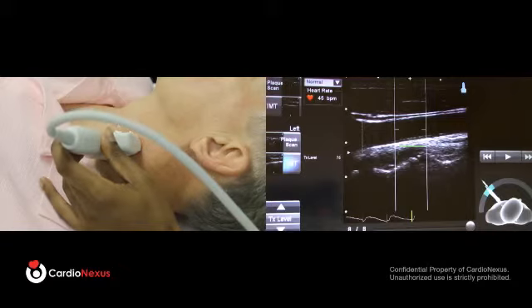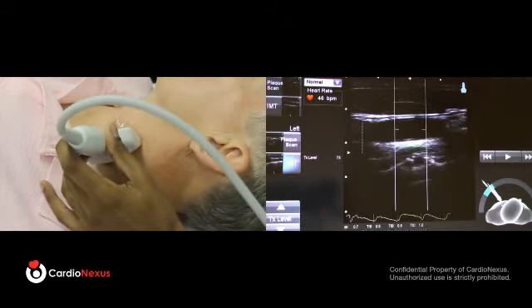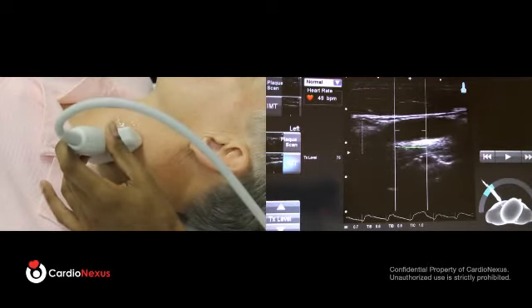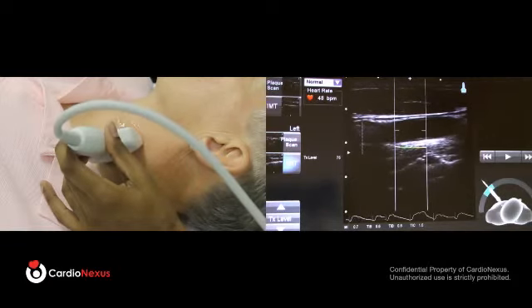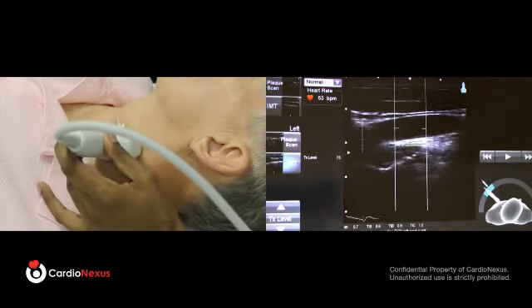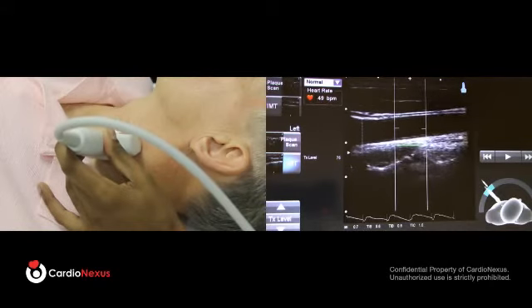So I'm going to do that one more time. In the case where you've located the artery, but it's considered an oblique view, kind of an oval shape, where it's clear in the center of the screen and unclear or fuzzy on the right and left sides of the screen, the corrective movement to make is simply rotating it either clockwise or counterclockwise until the artery opens up across the screen. And in this case, as you can see, I'm rotating it. The artery is now clear across the screen.